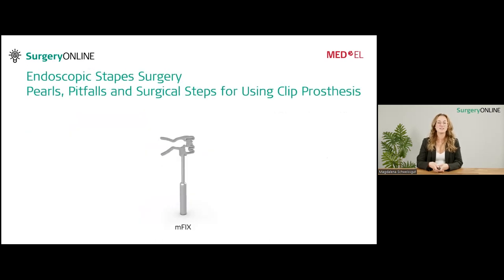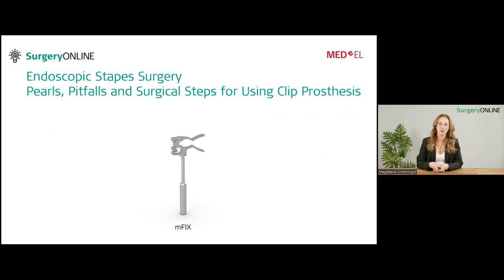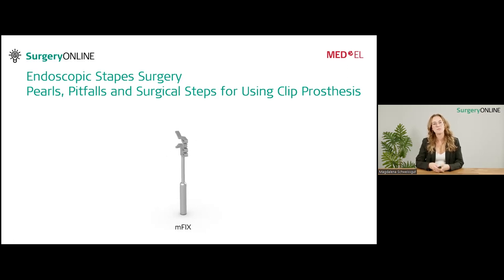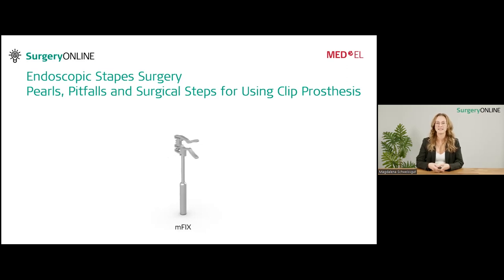The prosthesis we will see today is the MFIX stapes prosthesis from Medel — a stapes prosthesis with a self-retaining clip that does not need manual crimping or a laser. It can simply be pushed over the long process of the incus and will stay in place. It is available in functional lengths from 3.5 mm to 5.5 mm and piston diameters between 0.4 and 0.6 mm.